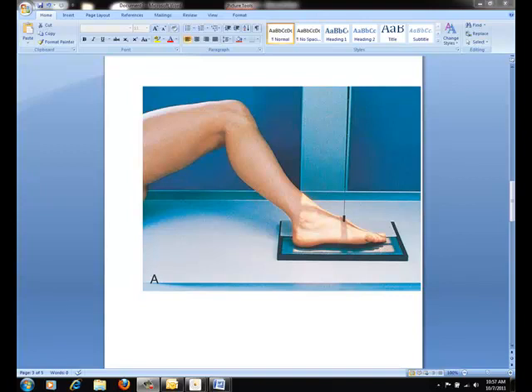For this position, simply rotate the patient's leg medially until the plantar surface of the foot forms an angle of 30 degrees to the plane of the IR. If the angle of the foot is increased more than 30 degrees, lateral cuneiform tends to be thrown over the other cuneiform bones. In some instances, an angulation of only 15 to 20 degrees is sufficient for a medial oblique projection.